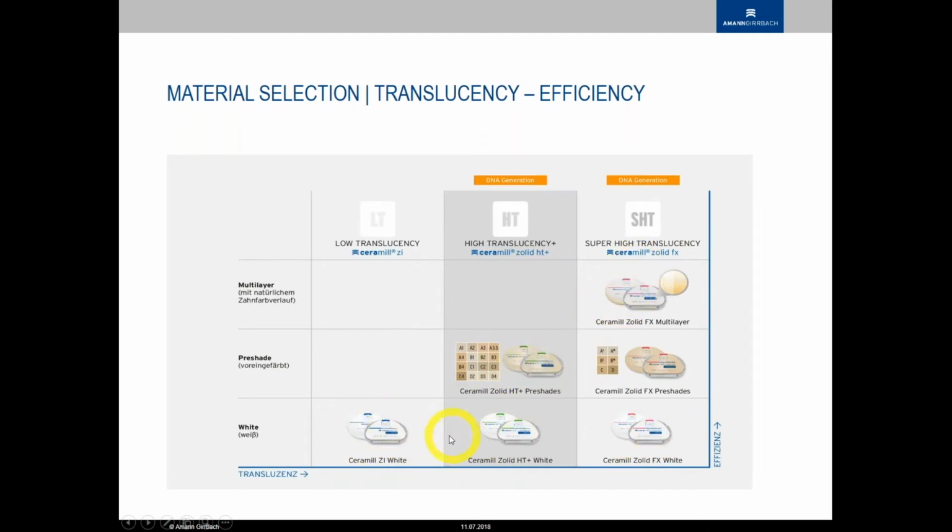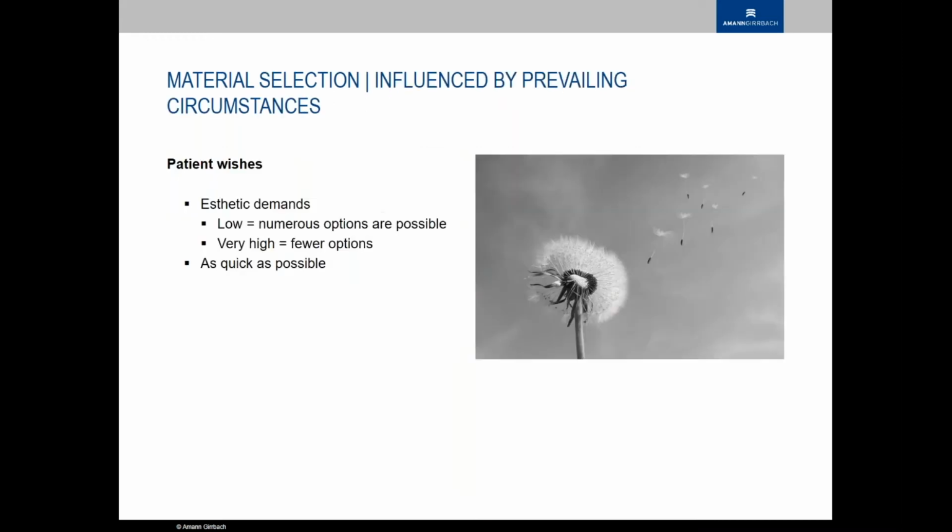And if somebody's using the white zirconias, it's those three here. With the pre-shaded ones you're a little bit more reliable, and you get repeatable results easily and quickly, whereas with the white zirconias your blank library might be a little bit less extensive. You have more variety with the vertical heights available, you can save maybe a couple of bucks per restoration there, and you're a little bit more customizable.